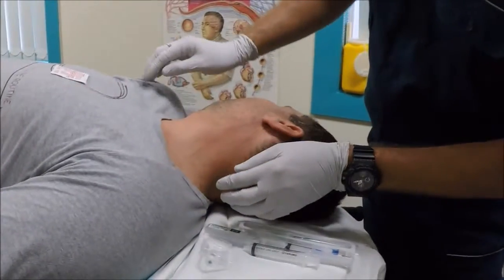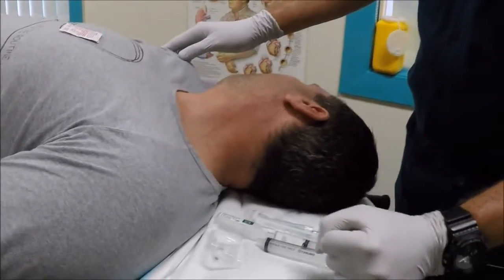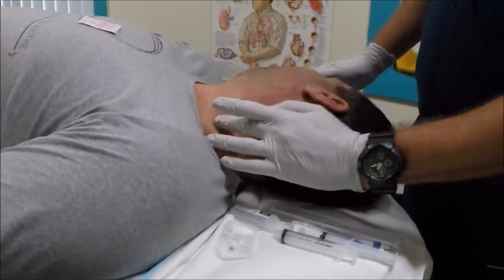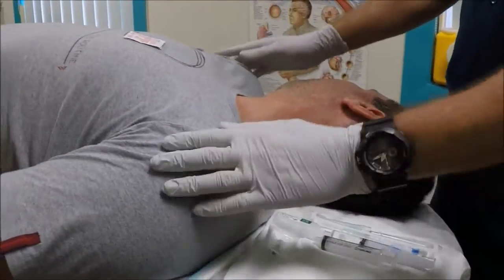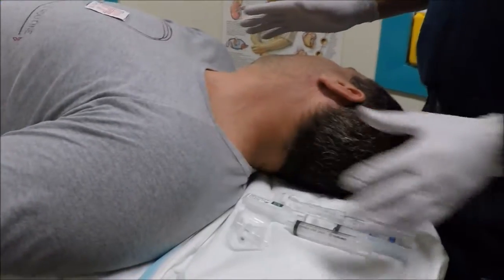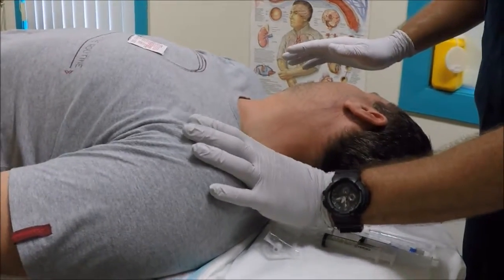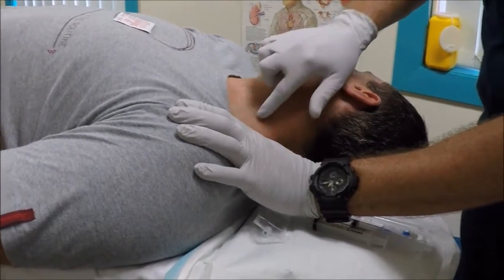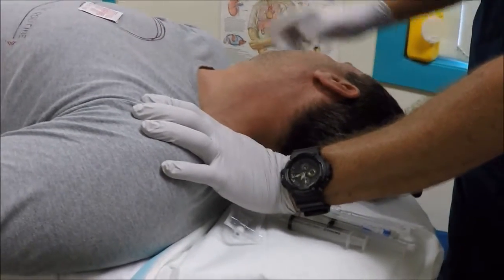Now if Brian takes a breath in, we'll notice that because of the respiratory pump and his respiratory drive, as the intrathoracic pressure reduces, he gets venous drainage into his thoracic cavity, into his heart and into his circulatory system again. So obviously we don't want that to happen. One way that we can control for that respiratory pump is to actually occlude the vein above the clavicle with one hand, and we can see that we can then get engorgement of the EJ vein.